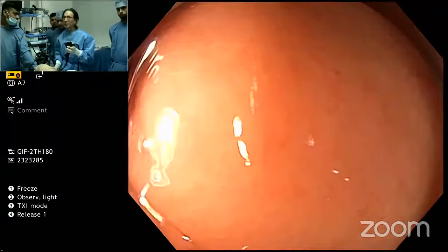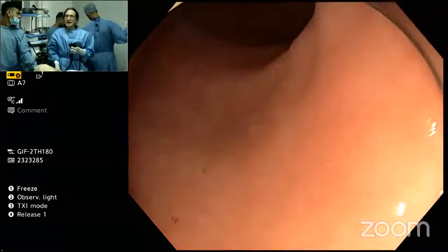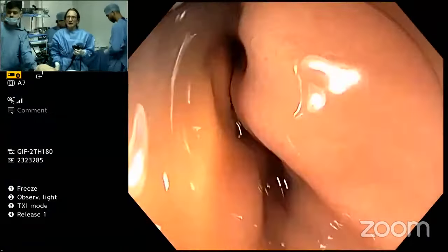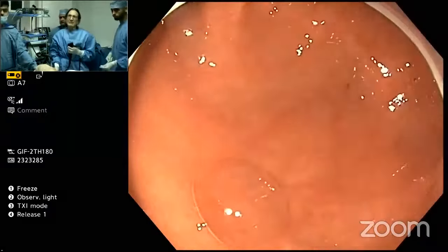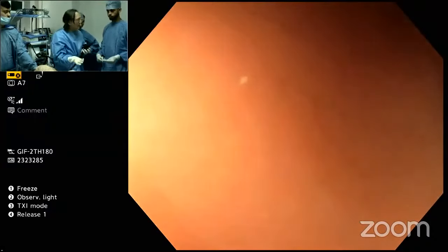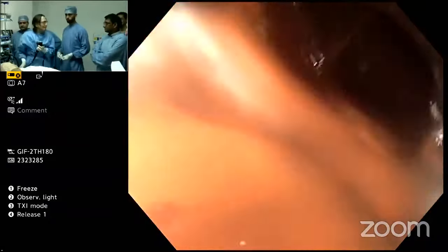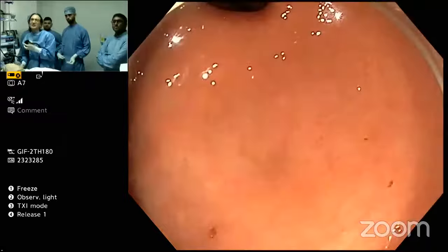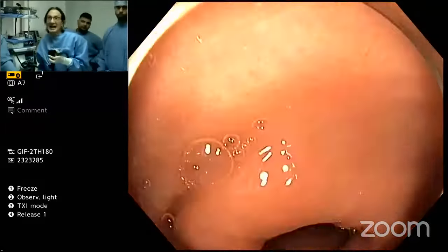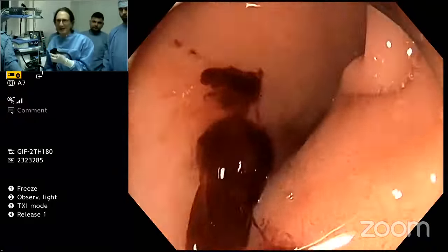So there we've got it. We can flush this off a little bit. And now if I have any remaining time, let me see if I can get the anchor. Can you just go in the room next door and grab another one of the anchors? Or just give me the anchor there, because I think the anchor still works. Now that I'm thinking about this, we've done the job, and in a way, I feel that to put an anchor in now is not necessary. So I think we'll just stop here, because there's not an indication that I can justify, even as much as I'd love to show you and as much as I'd like to see. First, do no harm, right? That's the motto of our practice.